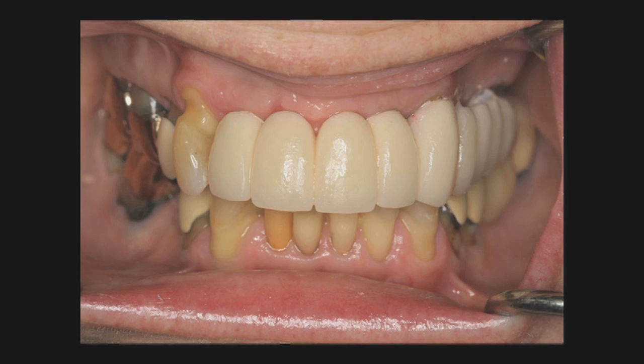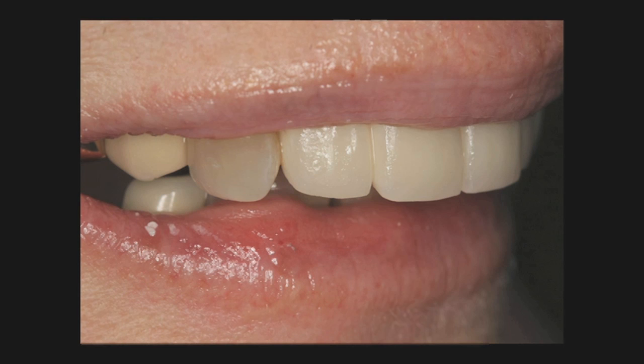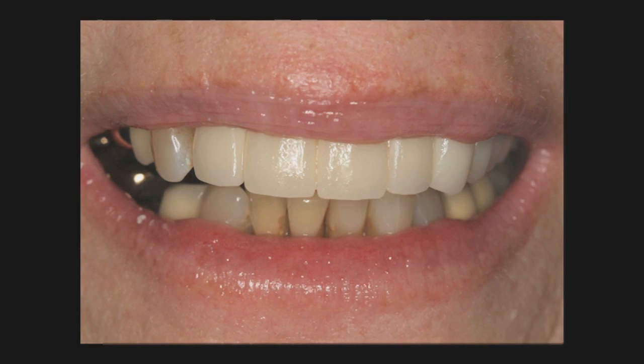I knew the aesthetics and function of her existing bridge was compromised. This prepared the patient for implants in the future in teeth number 12 and 13 areas and eventual aesthetic redesign of her maxillary right quadrant. What a motivation we had for this patient to continue her aesthetic reconstruction. And we can see in the following photographs right and left lateral views of the temporary prosthesis placed immediately at the time of surgical intervention.